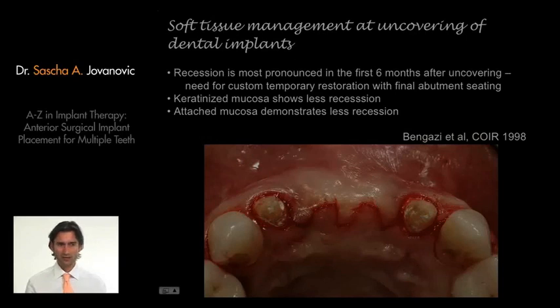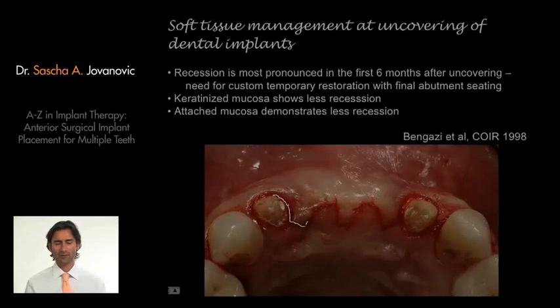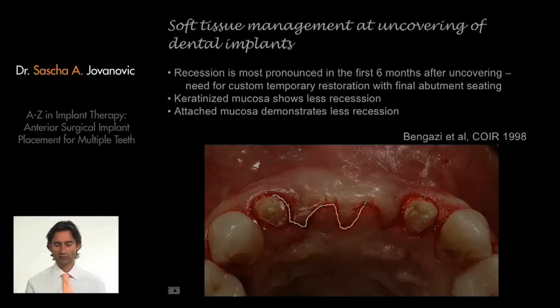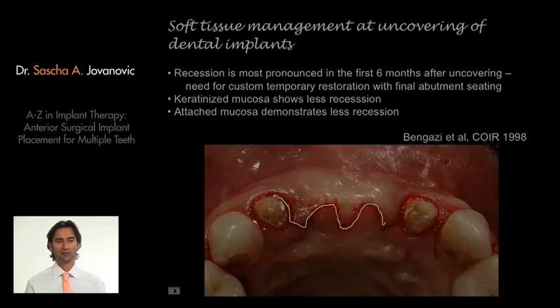My incision started off here. Then it moved to get me a papilla between the implant and the tooth. Then it creates a little round area to place it and adapt it around a healing abutment. Then I create again a soft tissue papilla for the space between the 2 implants. I create again space for the healing abutment and then the papilla.